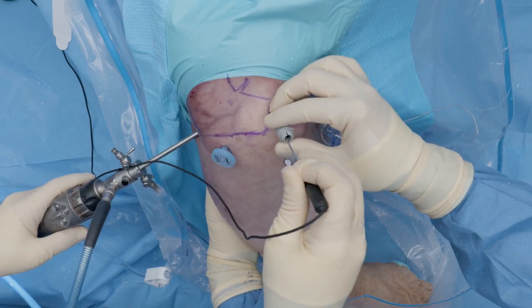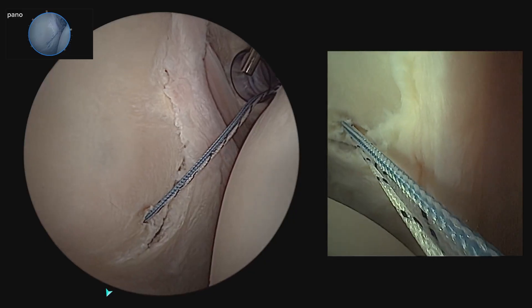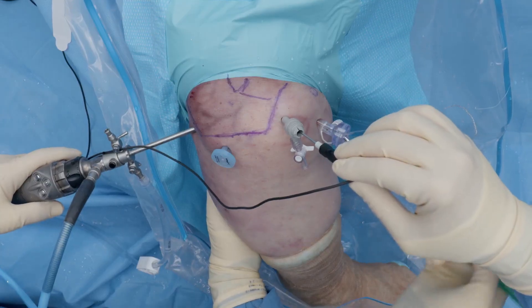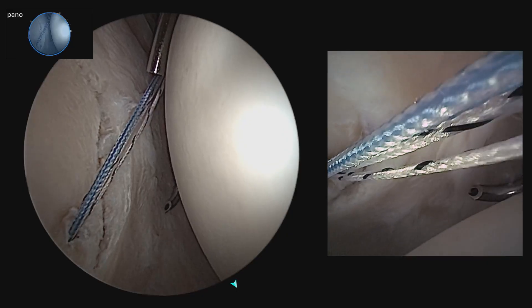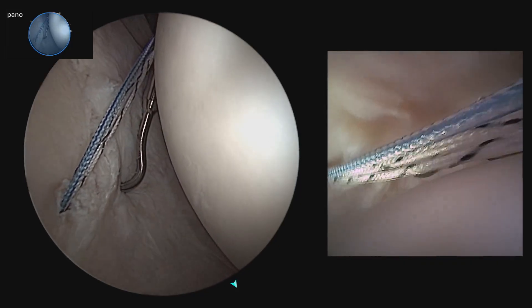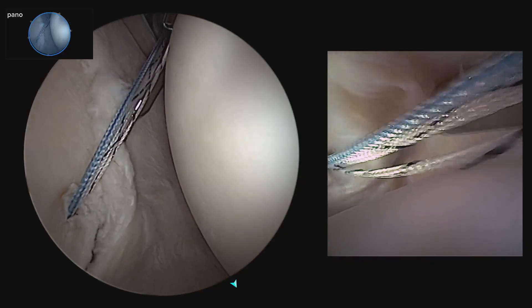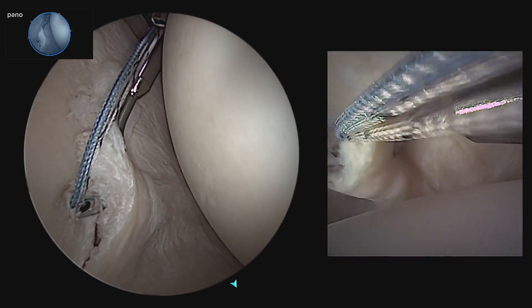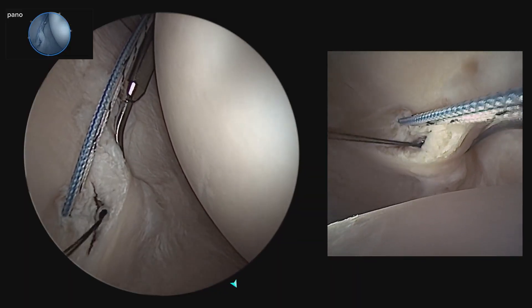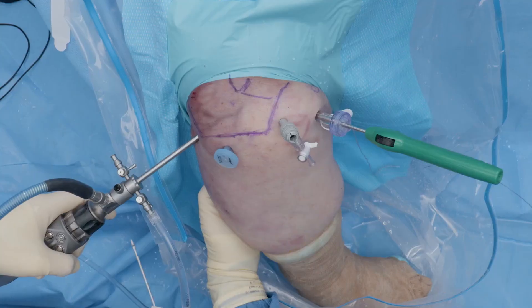Another benefit of using the nanoneedle is identifying how much capsule we are taking. I like to use the nanoneedle again in the ASL portal, coming down and holding it there while I grab my capsule. Using both views, I can see really how much capsule I am taking — from my posterior portal I see where I am aiming, and from the ASL with the nanoneedle I can identify how much capsule I am grabbing in relation to the labrum.